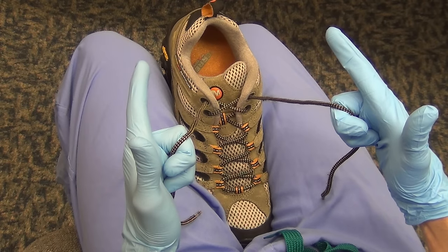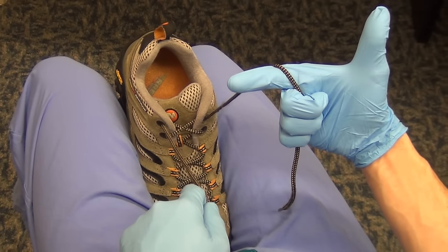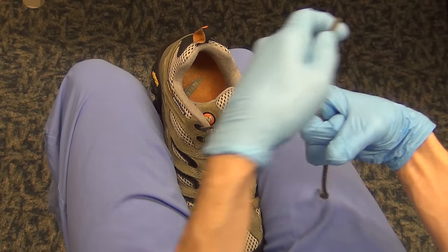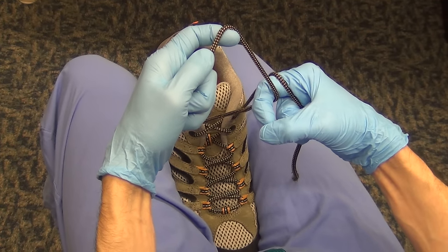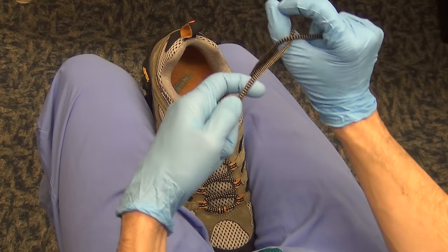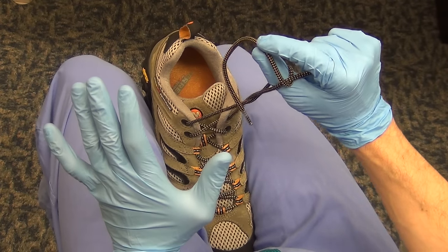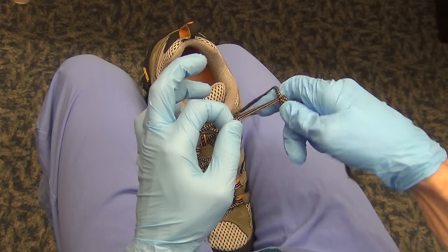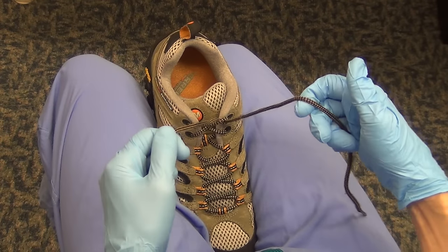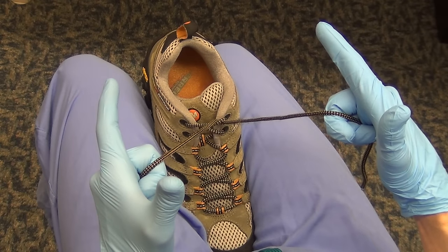Starting with the index finger, you're going to do what I call internal rotation to create half the suture circle. Then complete the other half of the suture circle so there's a loop of suture around your index finger. Make a finger circle and push your opposite finger — in this case the thumb — through the suture circle. Pick up the tail, pinch it between your finger and thumb, push the tail back through the suture circle and tie it down. Practice the index finger over and over until it becomes muscle memory.